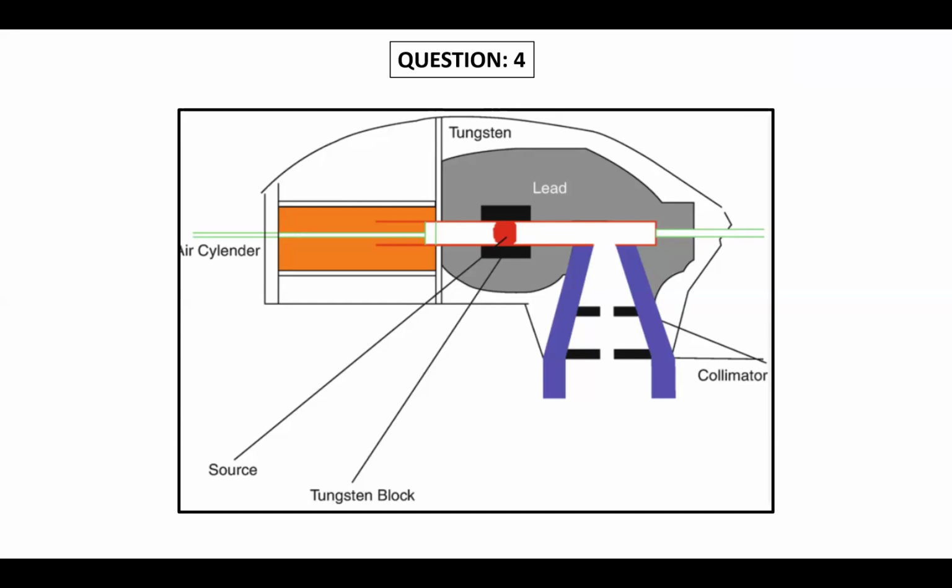The collimators now, advanced MLC-based cobalts have also come, but previously the main things were fixed collimators and custom blocks. In the LINAC we can use primary and secondary collimators, that is, jaws. Trimmers will be there in the cobalt, though not in all machines, to reduce the penumbra. And what are the maximum and minimum field sizes in a cobalt machine?